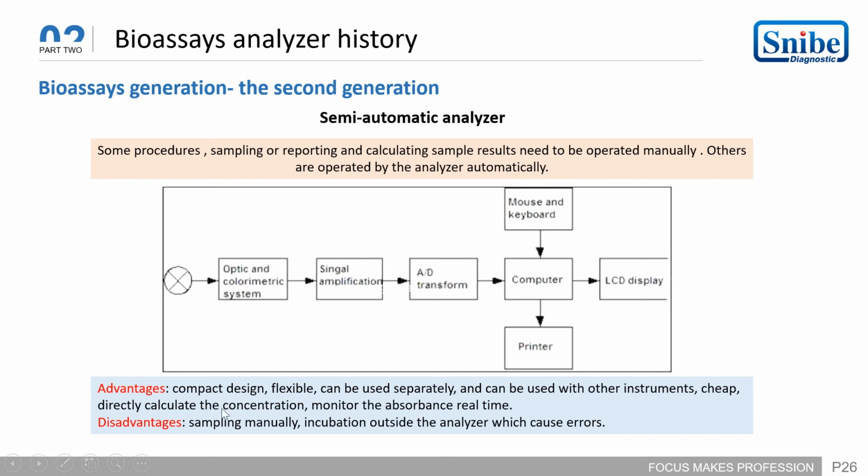Its advantages: compact design, flexible, can be used separately and can be used with other instruments, cheap, directly calculates the concentration, and monitors the absorbance in real time. But the disadvantage is sampling manually, and incubation outside the analyzer, which causes errors.